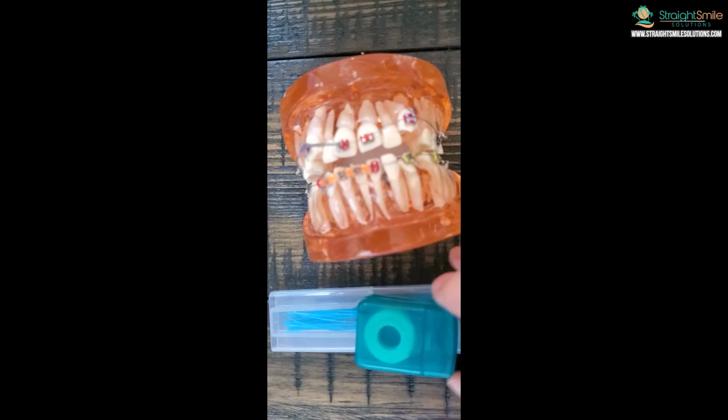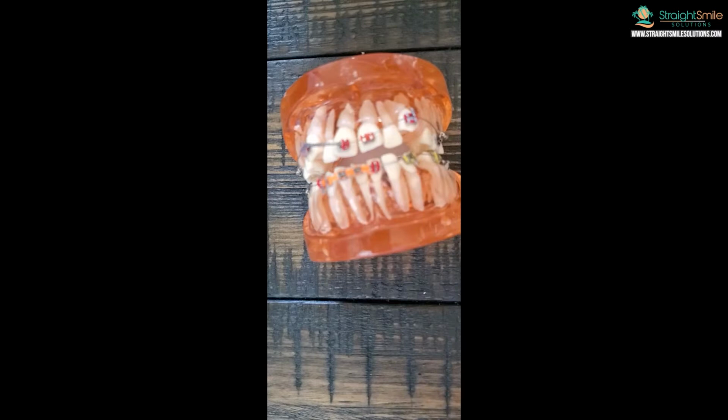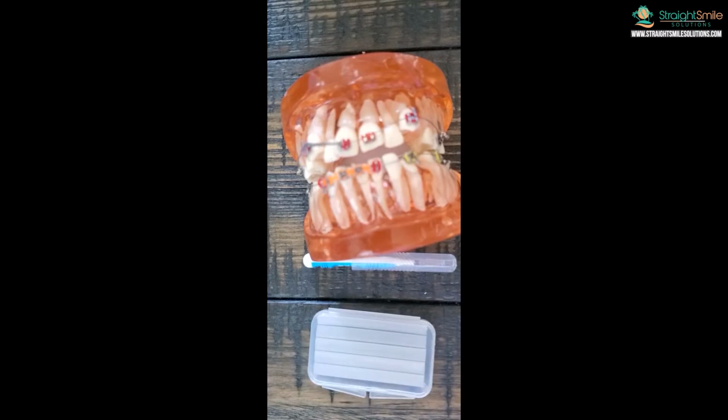Okay, the other thing you're going to need a lot of is proxy brushes, and they come in all different shapes and sizes. Find the one that's comfortable for you, okay? And you're going to need a lot of wax. And there's another brand of wax called Ortho Dots, O-R-T-O Dots.